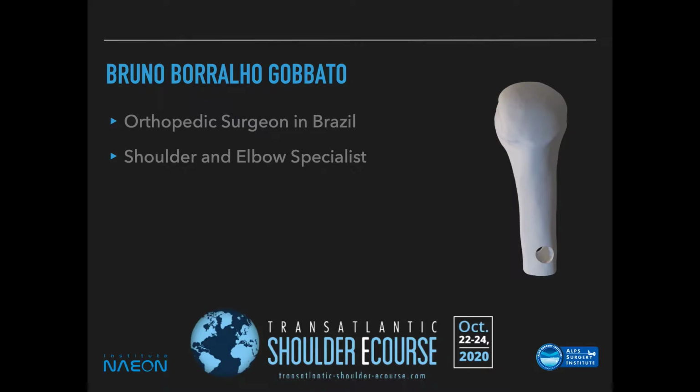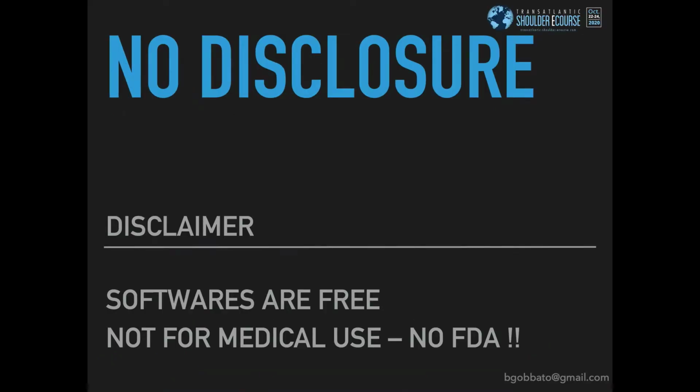I'm an orthopedic surgeon in Brazil. I'm also a shoulder and elbow specialist. I have no disclosure for this presentation, but I have one disclaimer. The softwares I'm going to use here are free. Everyone can download and use them for free, on Mac and Windows, whatever platform, but they are not for medical use, so they are not FDA approved or ANVISA approved, so use them as your reference. These are not medical softwares. That's an important disclaimer for this presentation.